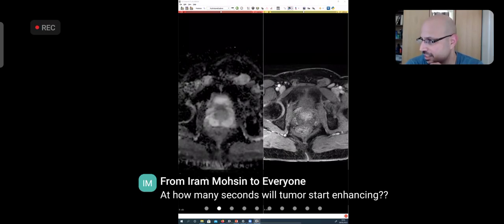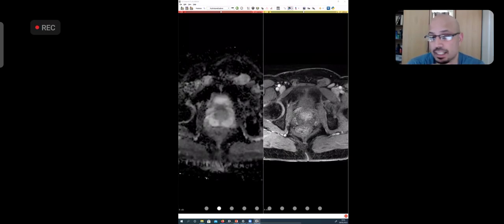We see it arterialized, and another thing, HCC इधर मैं चला गया. You must know कि जो arterial phase होती है HCC imaging, it's called late arterial phase, and that is the reason HCC enhances in the late arterial phase. If you do a very early arterial phase, and you should read more about what is late, what's early. If you do it too early, some other cancer metastasis, neuroendocrine tumor metastasis may start enhancing. So, the thing is that they've got mal-structured vessel walls, they enhance, and that's why also in prostate cancer, it's the early enhancement and early washout we're looking for.